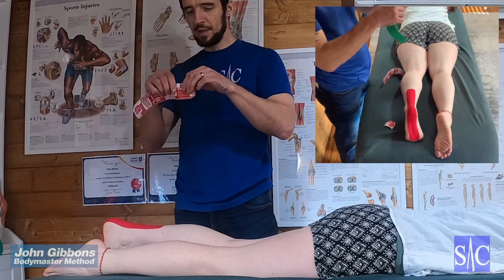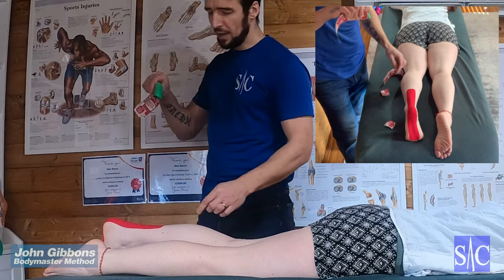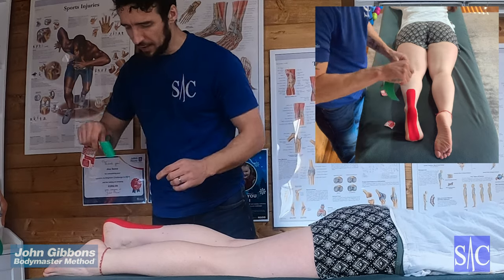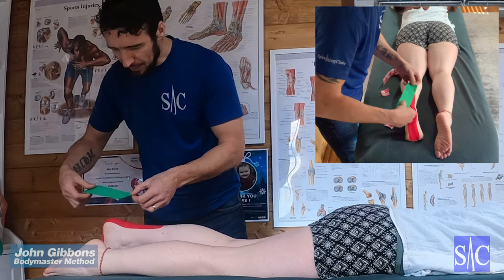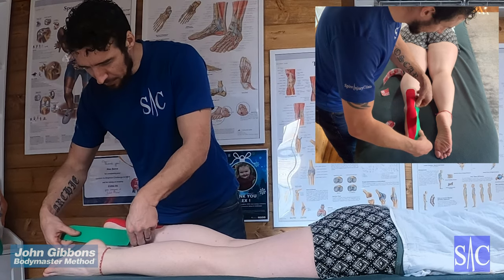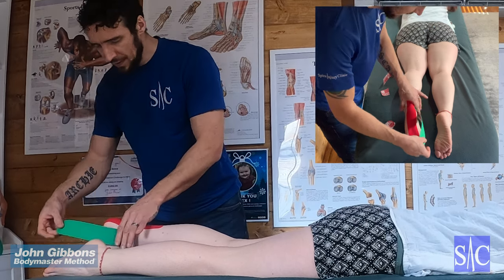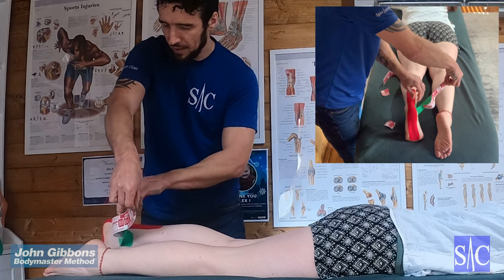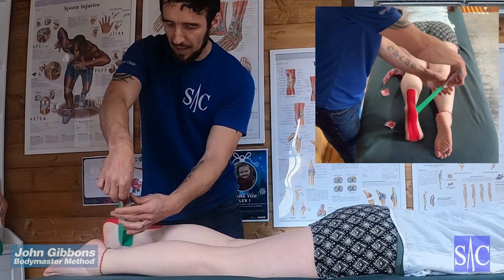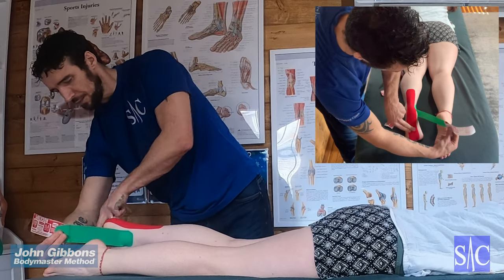For strip two, again remove the first bit of backing — about an inch or so. Find the medial malleolus, the inside ankle bone, and paste the tape straight over that ankle bone with no stretch at all. Then secure it, pull the tape so the backing comes off, and peel it back to about an inch. Now come straight through the sole of the foot.